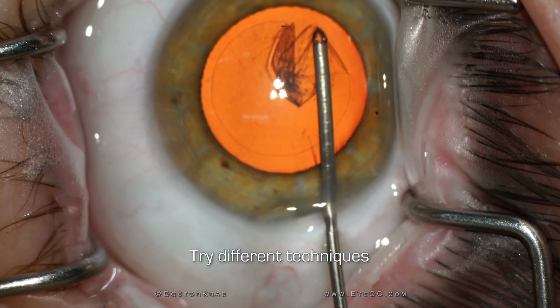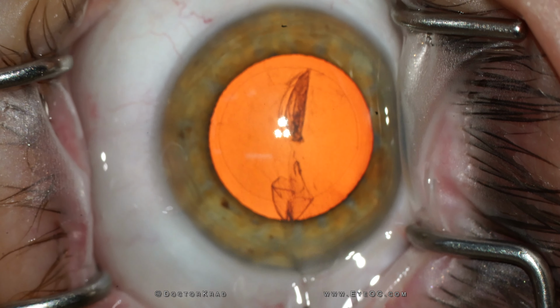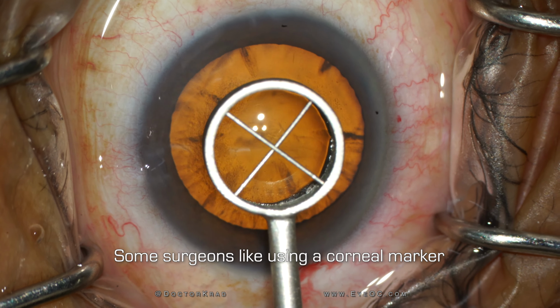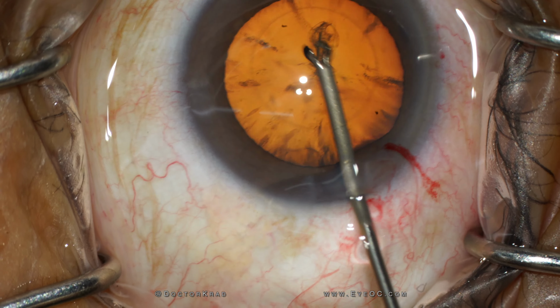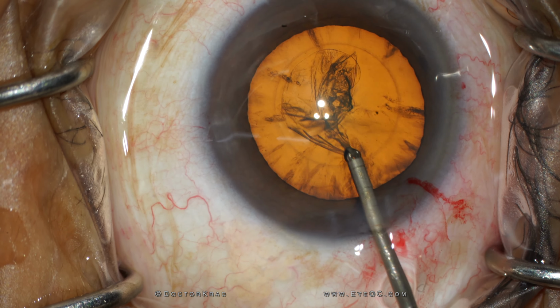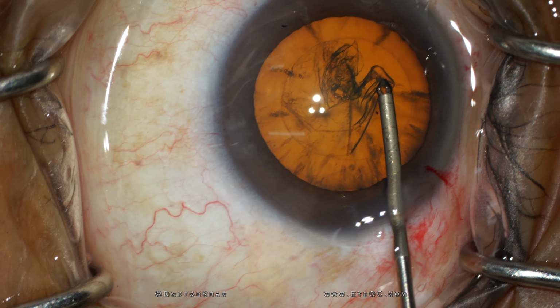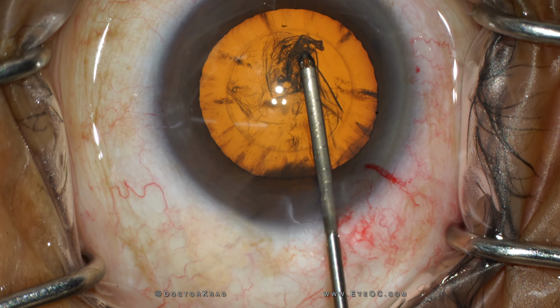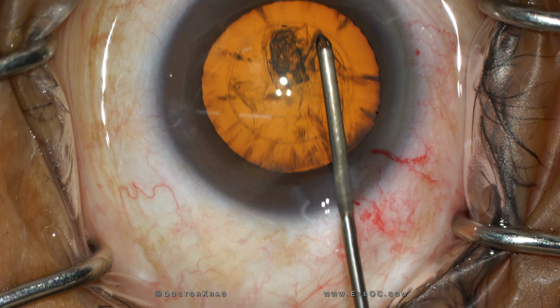My first tip is to try different techniques, because what works for me might not work for you. Here I am trying a corneal marker, it's 5.5 millimeters in diameter, and it works well as a guide if you want to be more consistent with your RHEXIS. And you just trace the outline of the marker, although it's in a different plane than your RHEXIS. It's more anterior because you're marking the cornea. And it does require you to have an extra instrument. Nonetheless, it's a very reasonable option.